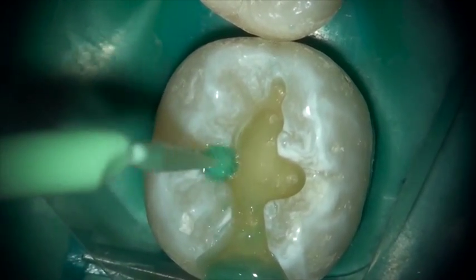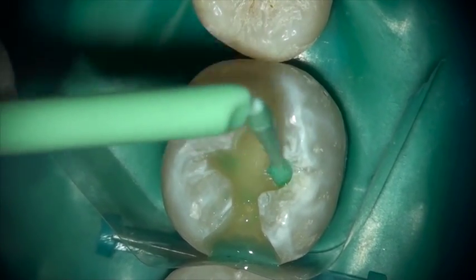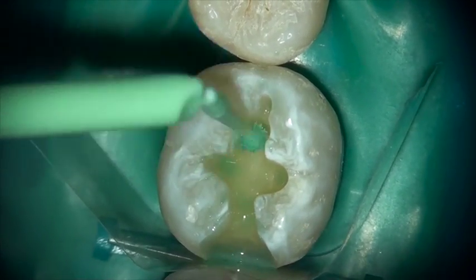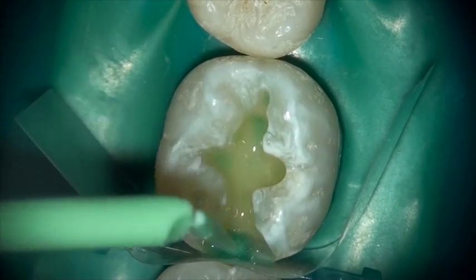I highly recommend using the optional conditioner. It removes the smear layer and increases the bond strength of Equiaforte to the tooth. Simply apply it to the entire tooth structure and scrub it only lightly.